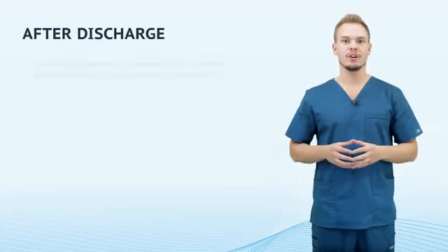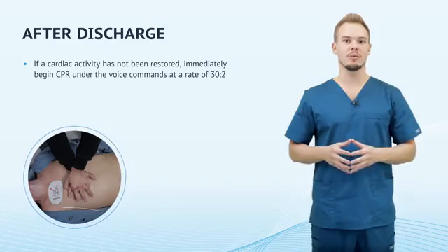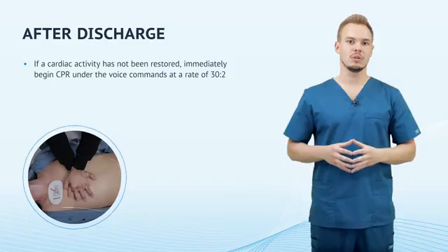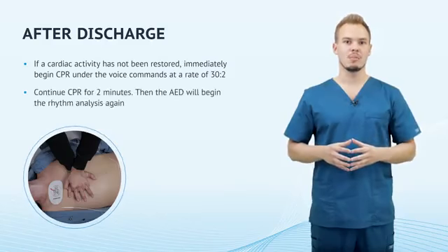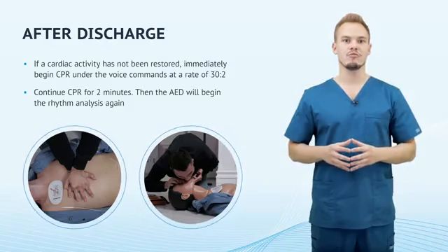After discharge, if a cardiac activity has not been restored, immediately begin CPR under the voice commands of the device at a rate of 30–2. Cardiopulmonary resuscitation must be continued for 2 minutes. Then the defibrillator will begin the rhythm analysis again, and so every 2 minutes.